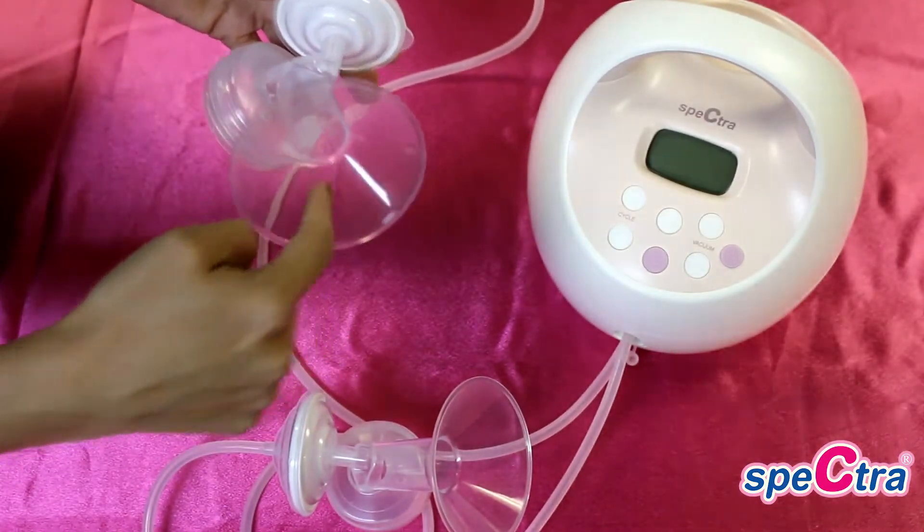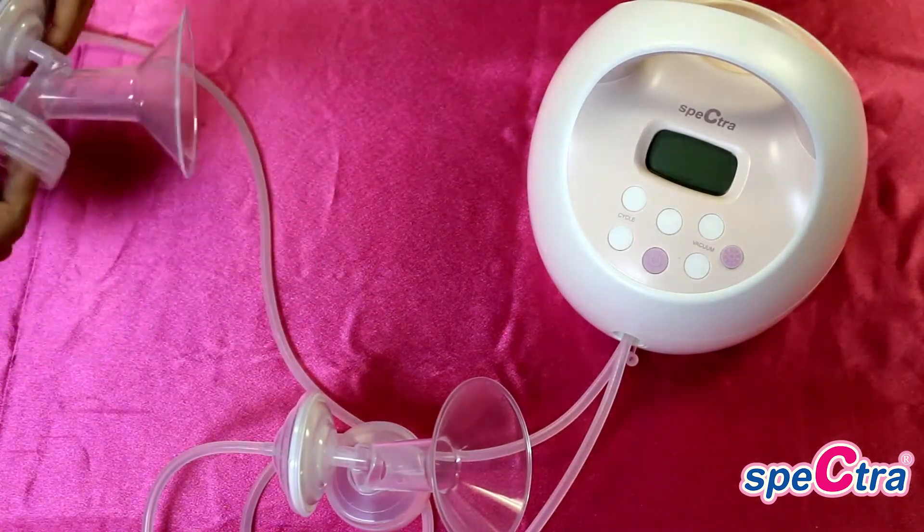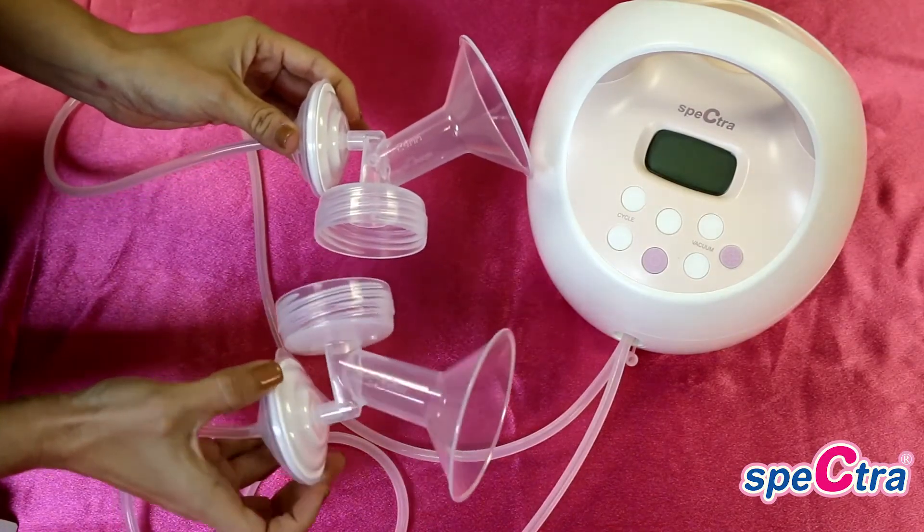Having the proper fitted flange can affect comfort, milk supply, and suction drastically. A lactation consultant can also properly fit you for the correct flange size.